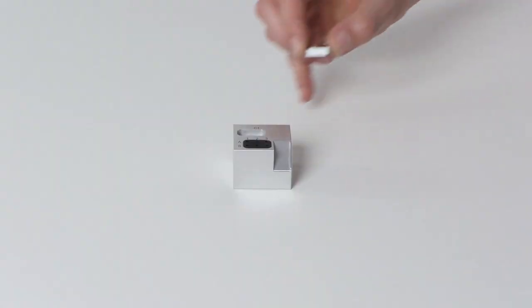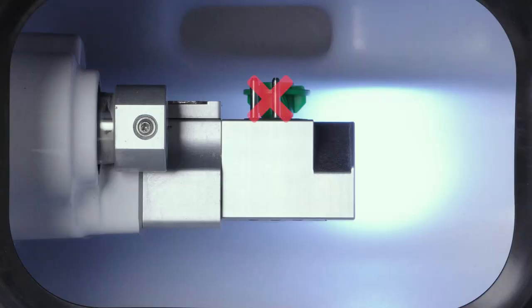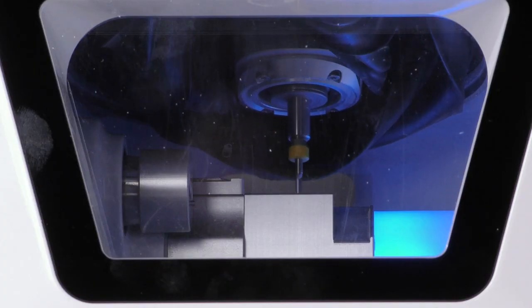In this video we will show you how to exchange the tool magazine inserts and tool magazine holders of your E4.